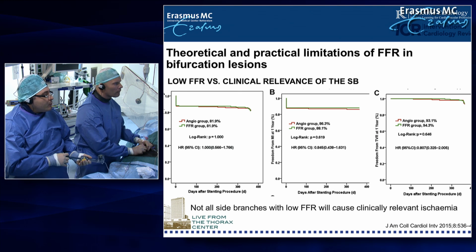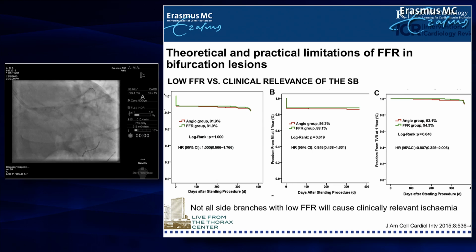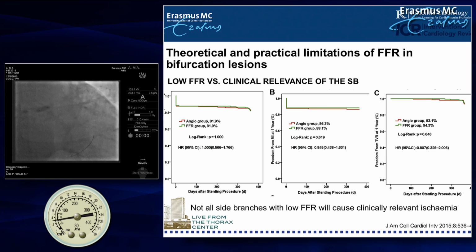So we were a little surprised to see this data. We were expecting that FFR would give us a much higher advantage in terms of clinical outcomes.